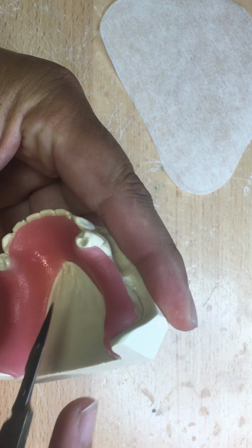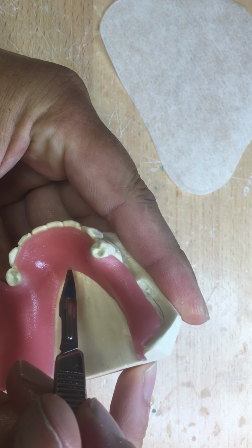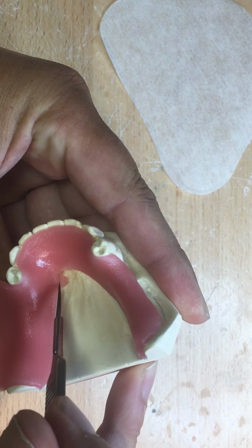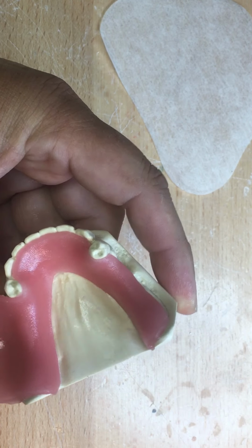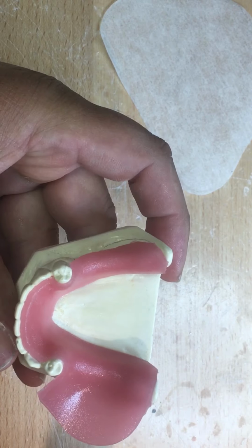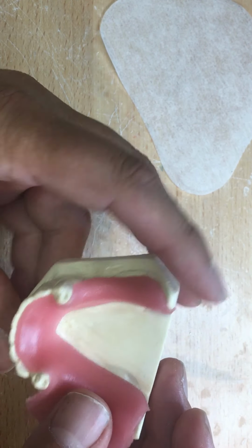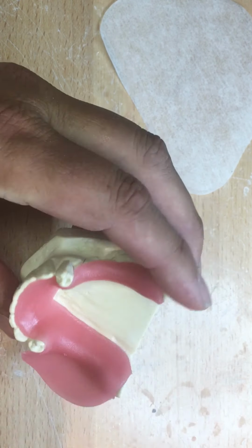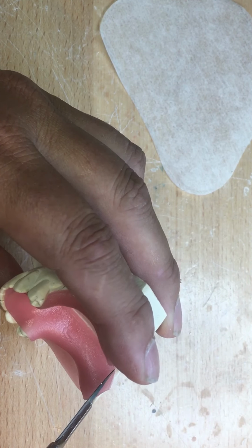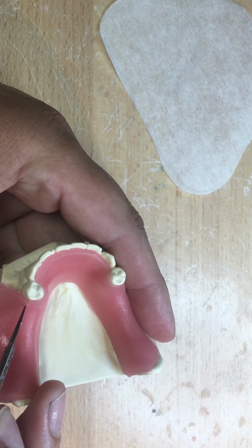What I see happening in the marketplace now is: oh, how much? $40 for a diagnostic tool? Let me go without it because I got away with it last time. Little do we know the practitioner got away with not using one when there was tooth-to-tooth contact with canine guided occlusion in a Kennedy class 1, 2, or 3, possibly even 4. But they fail to recognize that each edentulous scenario is different, requiring different diagnostic tools.